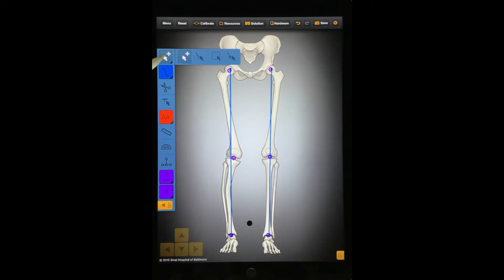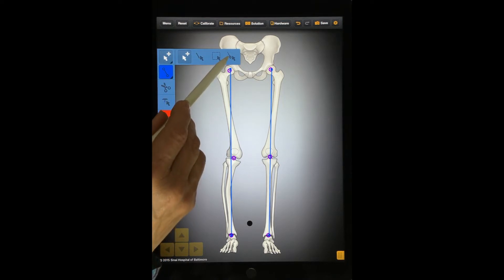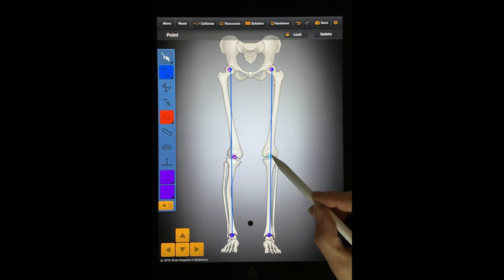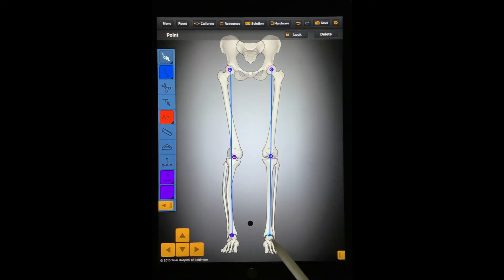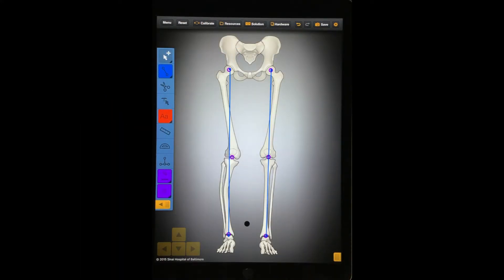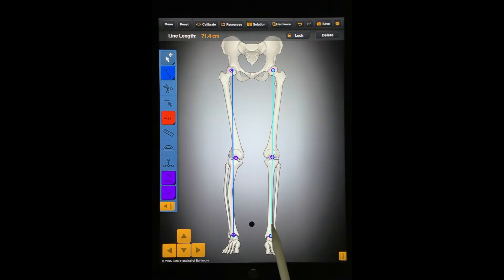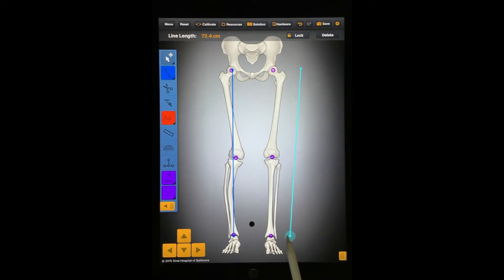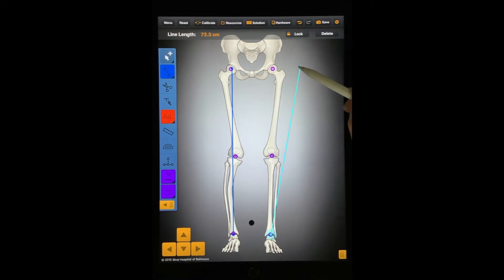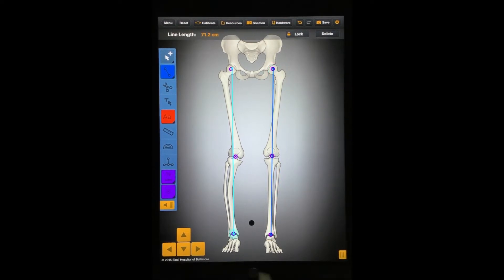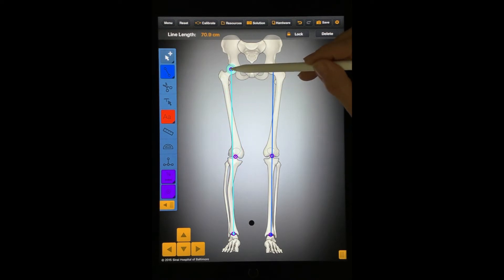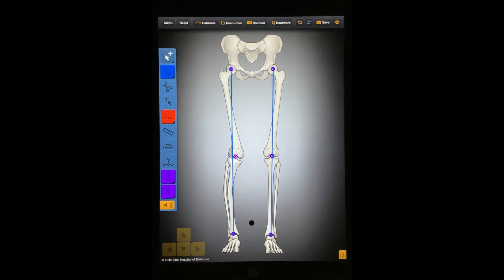If you press and hold the button, additional selection tools will appear. For example, choose the Dot Selection tool. When an object is selected, it temporarily becomes a light blue color. Select the Generic Selection tool — any line or dot can be selected. There is a difference between selecting the whole line or just one end of the line. When you select just one end of the line, a blue circle will appear. To unselect an object, tap on the far edge of the screen and then it will revert to its native color.